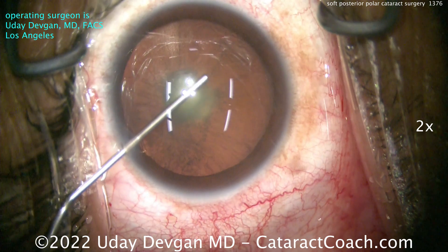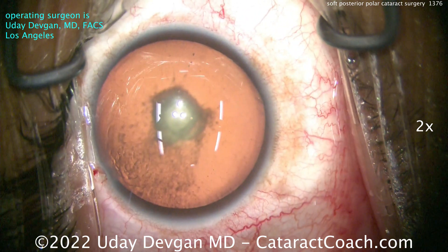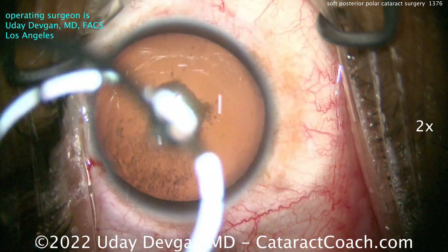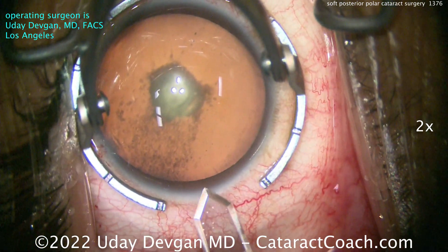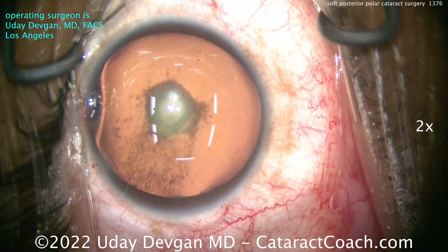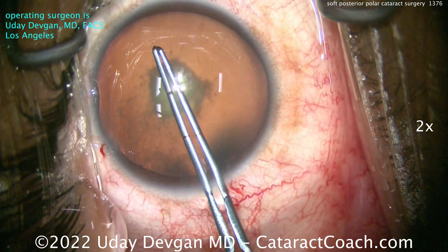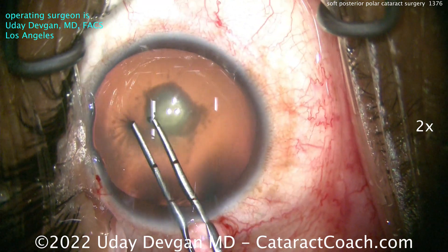You can see posterior polar opacity, and around it PSC spread — posterior subcapsular opacity spreading out like grains of sand. The patient has had this for many years; it's congenital and present in the other eye as well. I've been seeing this patient for a few years, and it's gotten to the point where he just can't live with it and has to get it fixed. So we're doing it.